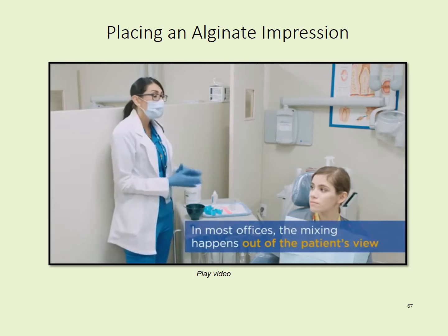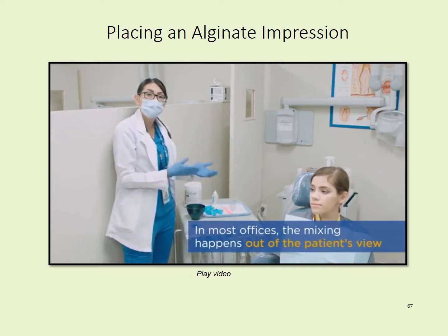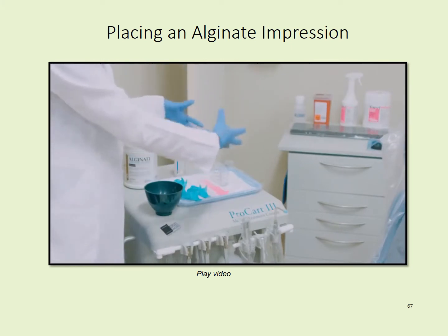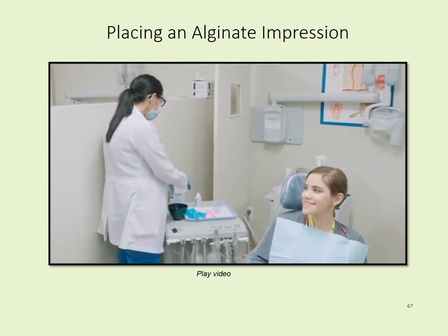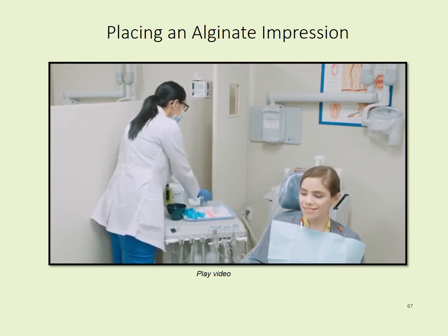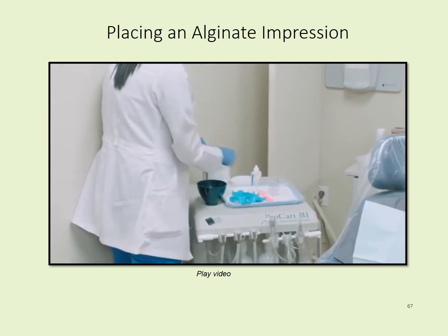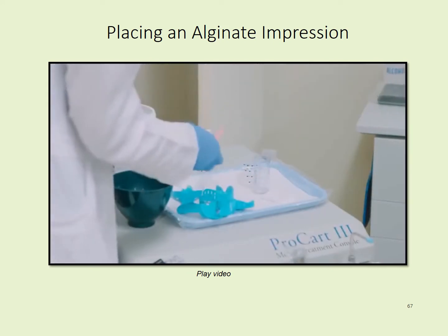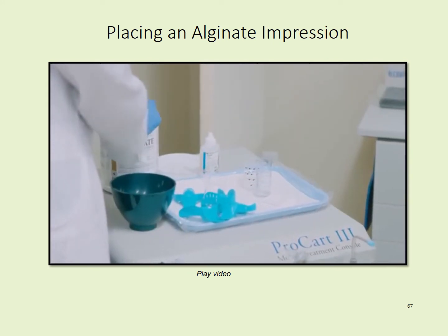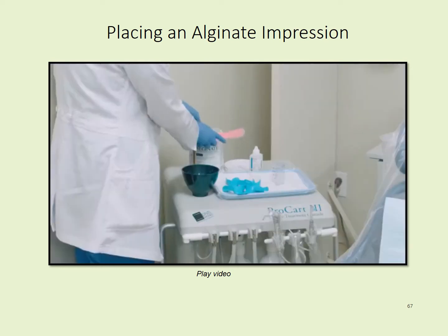Usually in an office, everything is done behind the patient, so the patient doesn't see the trying of the trays, doesn't see the whole setup here. Okay, Heaven, thank you for coming into the office today. The doctor requested we take some alginate impressions. So you take your scoops of alginate, use your spatula, and today we are going to use 3 scoops.